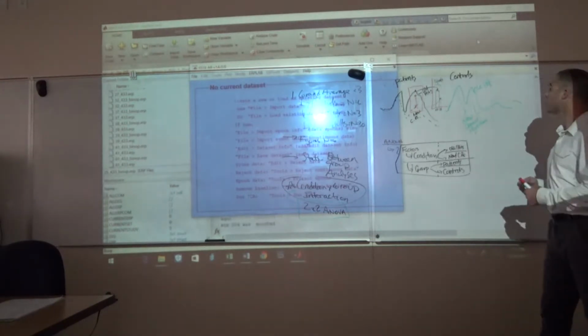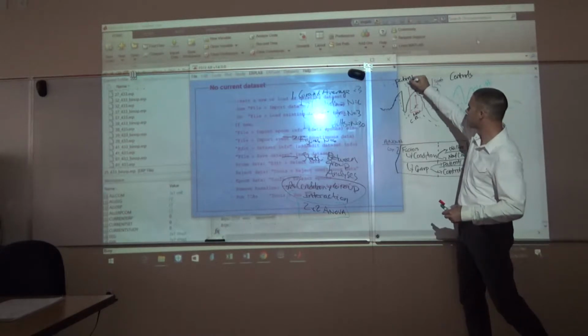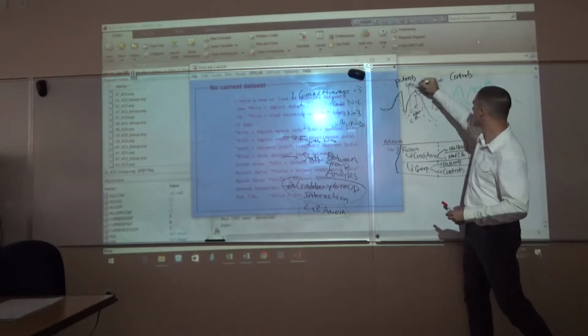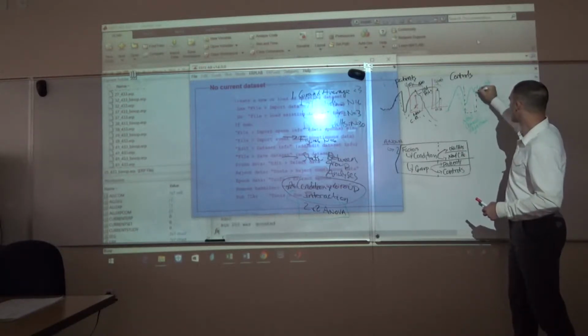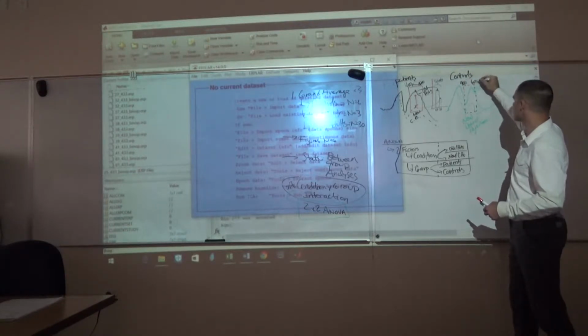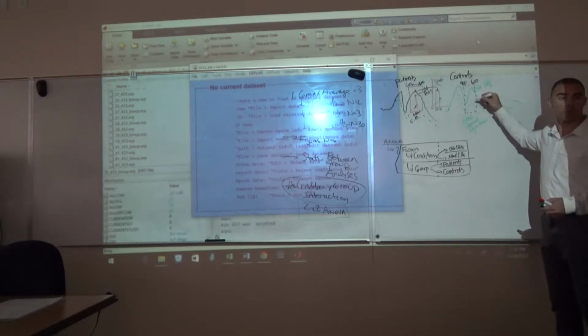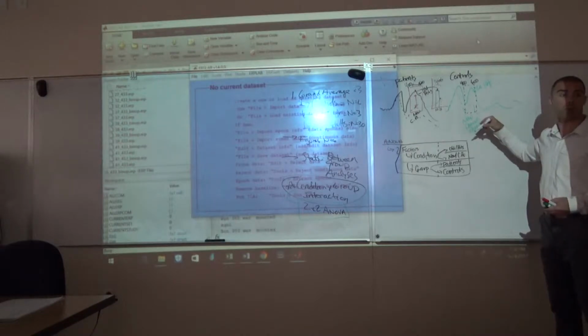Okay. So let's say that you want to take that same time frame, let's say this is 400 to 600 milliseconds, and you want to grab 400 to 600 milliseconds in our controls. How would that look? Kind of similar, right? Okay.